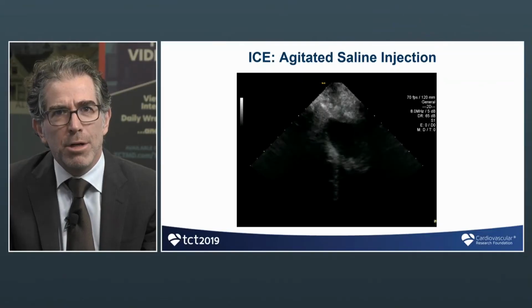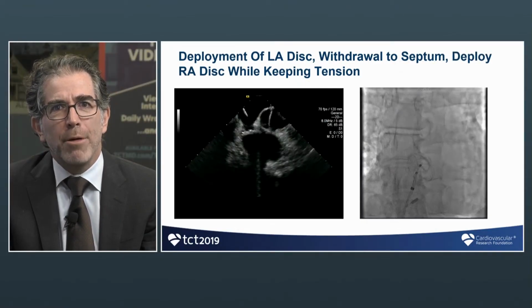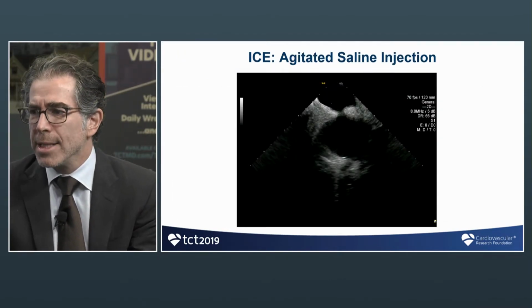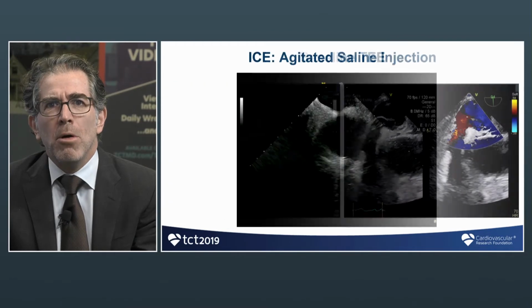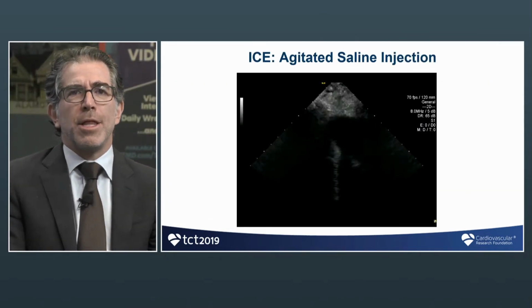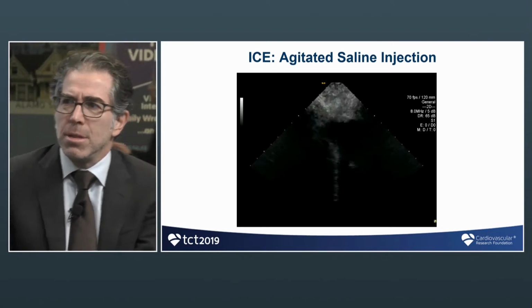Right. So let's go on with this case. We have a case of an aneurysmal septum, a large shunt, and a thick septum secundum. So, all right, let's actually go back one before we look at this. Tell me, with this case, Ignacio, for device size selection, is there anything you go into, like balloon size? Do you change your approach?